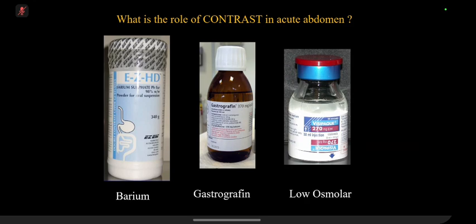If barium goes in, it happens quite often with us. If a patient is old and frail, and during the swallow examination they aspirate a bit of barium, we immediately see it and say, wow, what is happening? Stop, and we have a protocol with the AMU people. The patient is sent there, usually the physiotherapist comes, and the results are quite good.